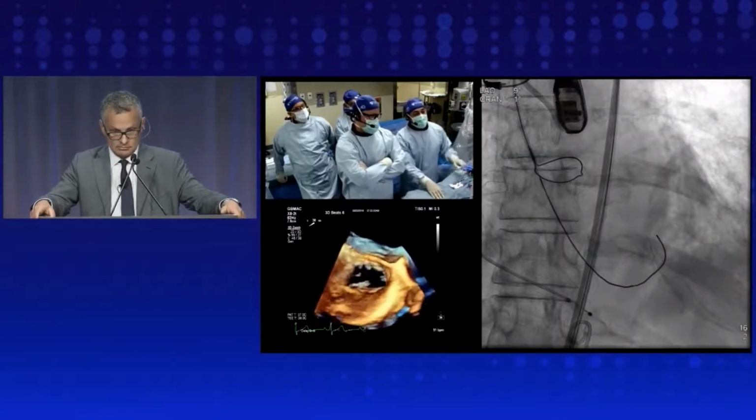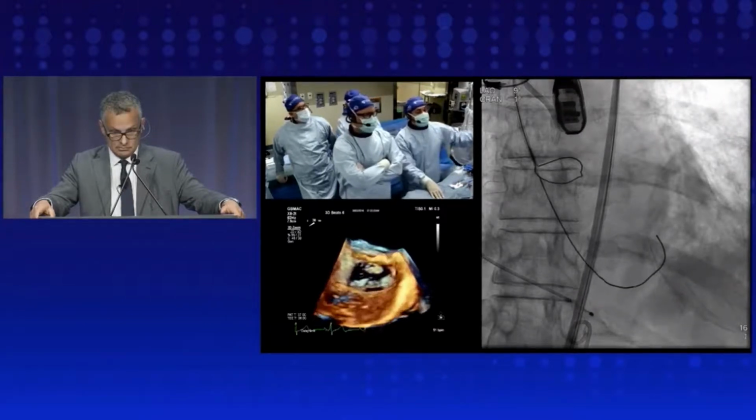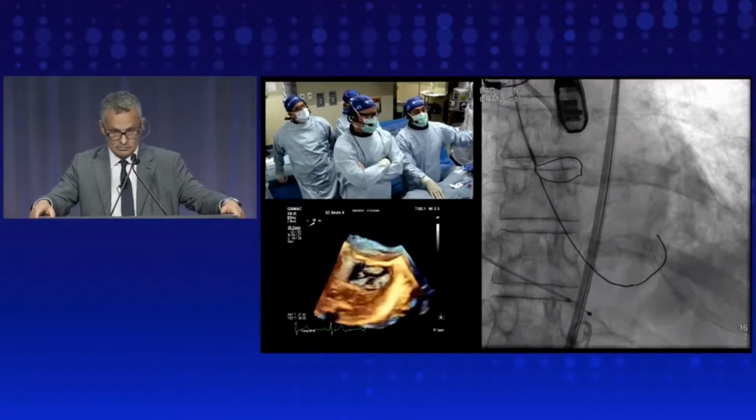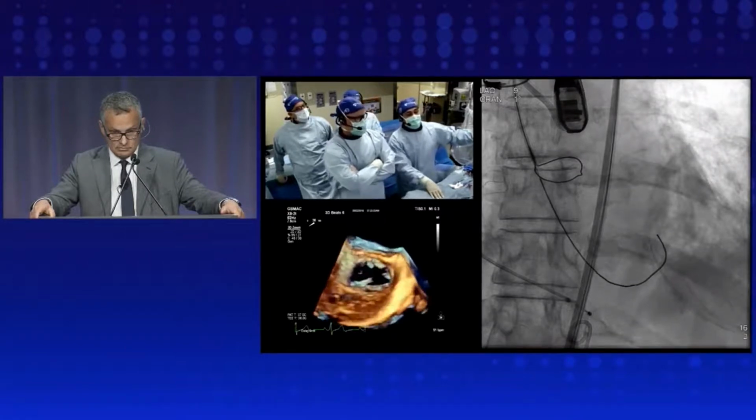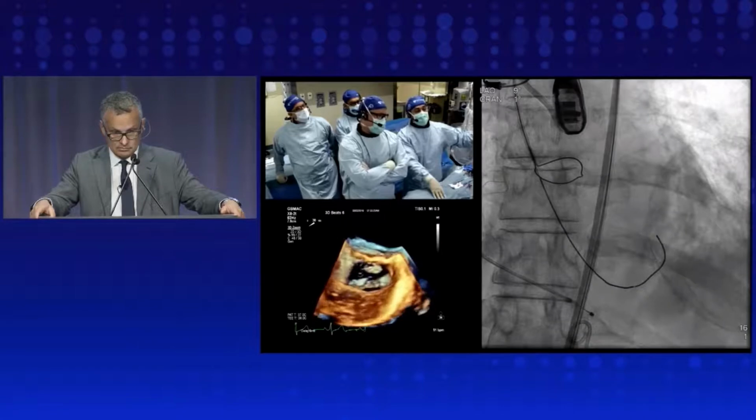Here we have a snare waiting inside the LVOT with a platinum wire to just anchor us. The snare is a gooseneck 20 millimeter. And we have an IM catheter bulging out of the AL4 guide.